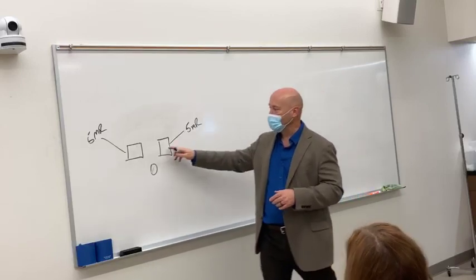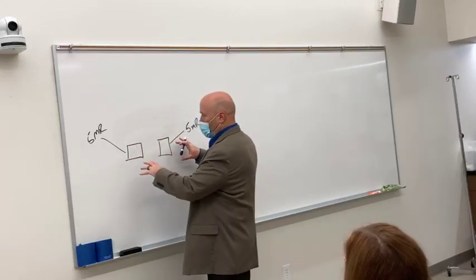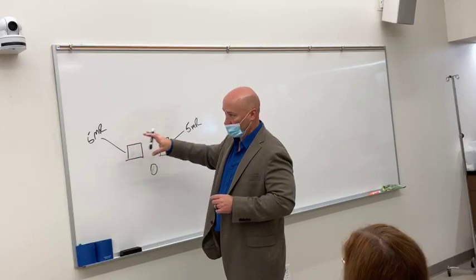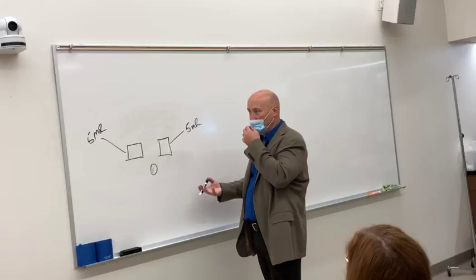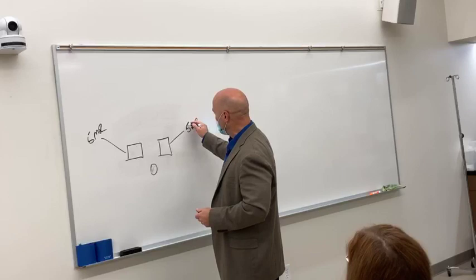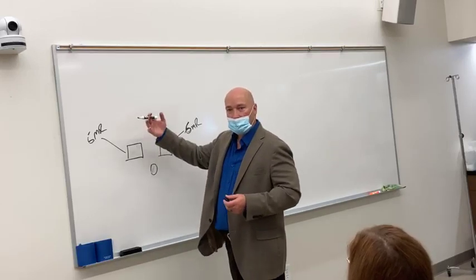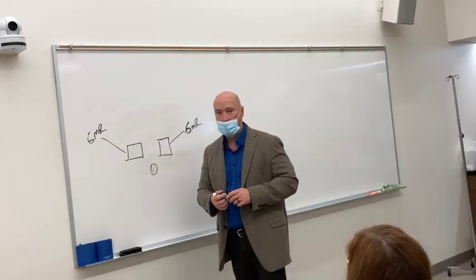Okay. The only thing these things do is measure the amount of radiation coming through the patient. It's preset to give you a decent density based on the exam type that you're shooting, so that if you've got patients of different size or different anatomy or different pathologies, these things should adjust. That adjustment may be that this one goes up to 6 and this one remains at 5 because this patient's got some sort of pathology over here. So it increases the time to terminate your exposure until you've got the proper amount.